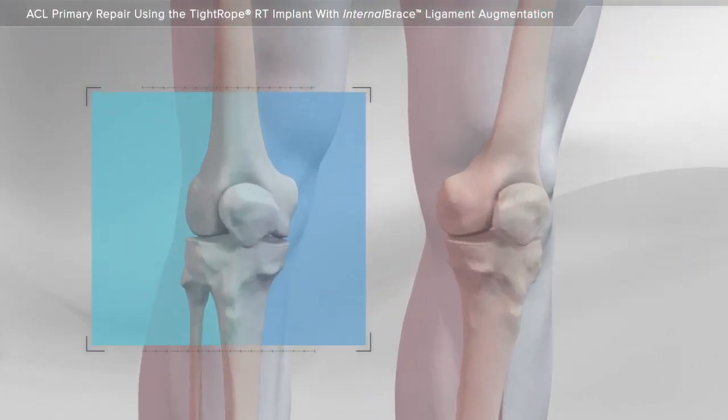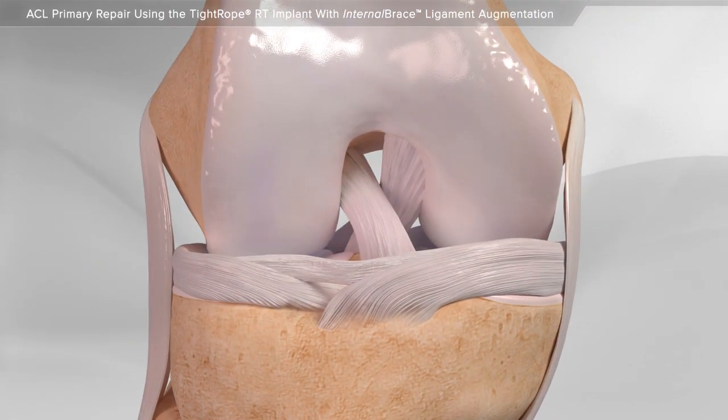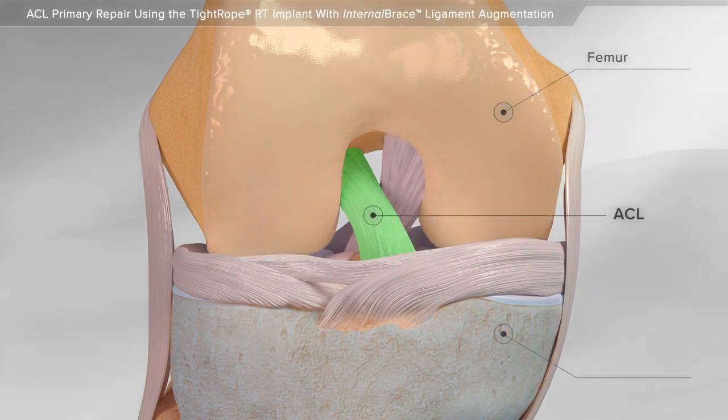In this animation, we will show the repair of the ACL in the knee using the tightrope RT implant. The ACL is a ligament that stabilizes the femur and the tibia.